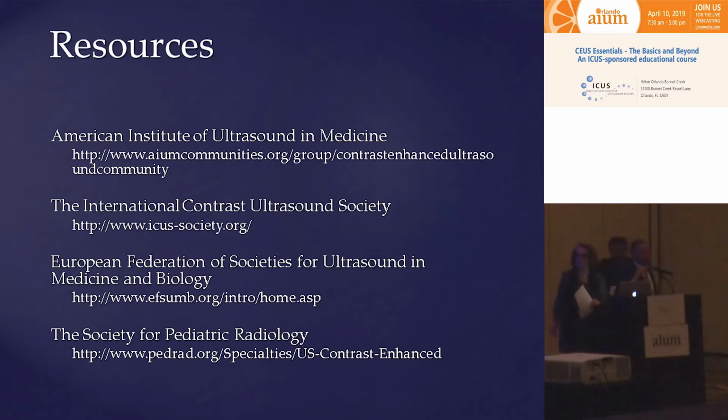All right. So the technique that is used for cardiac contrast-enhanced ultrasound is different from what we use for abdominal and other applications. In cardiac echo, they want to have a really tight, concentrated bolus to opacify a large glob of blood in a ventricle to see the borders and also to see holes. So this is a little bit different. We want to inject contrast quickly, but we don't want to hammer it because they really don't care about the dose they deliver. If they lose 20-30% of their dose, that's fine. But they want to have a tight bolus.